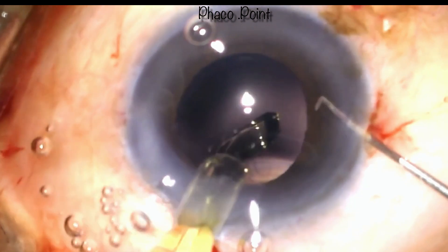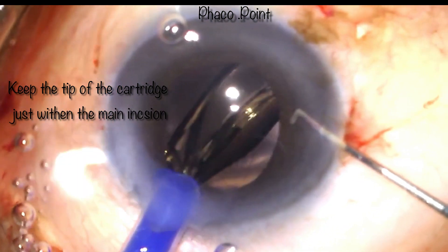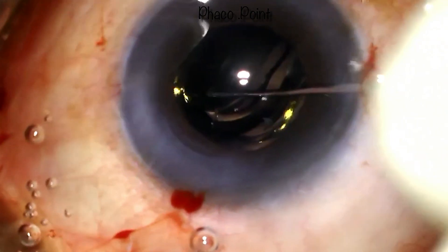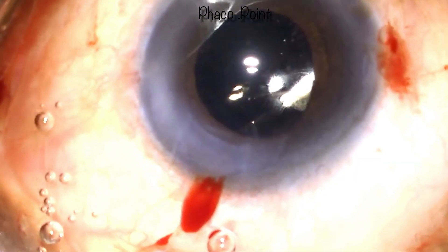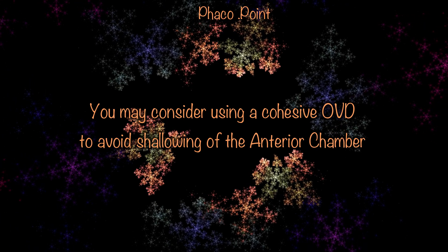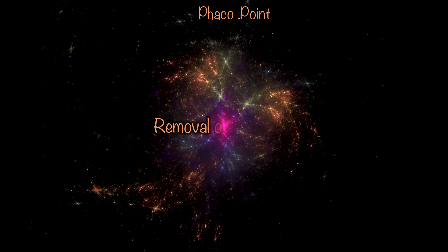Now, remember that if you are injecting a foldable IOL after enlarging the incision, there is a significant discrepancy between the size of the incision and the injector tip. While injecting, be careful not to accidentally introduce the cartridge too far into the eye, as that can damage the capsular bag and the posterior capsule. Maintain your cartridge tip at the incision itself and inject slowly and cautiously. Since there is a discrepancy between the cartridge and the incision you are likely to lose viscoelastic, so it may be a good idea to use a cohesive viscoelastic in this situation. Having injected the IOL, the trailing haptic is introduced into the capsular bag and we proceed to removal of the excess viscoelastic.